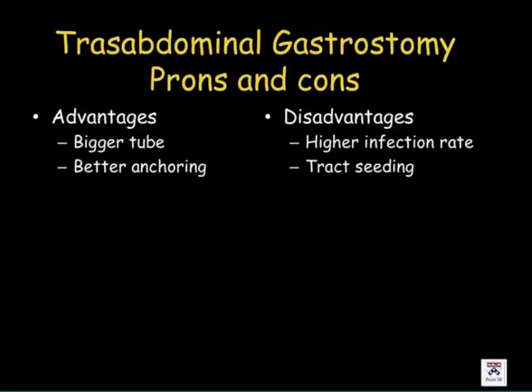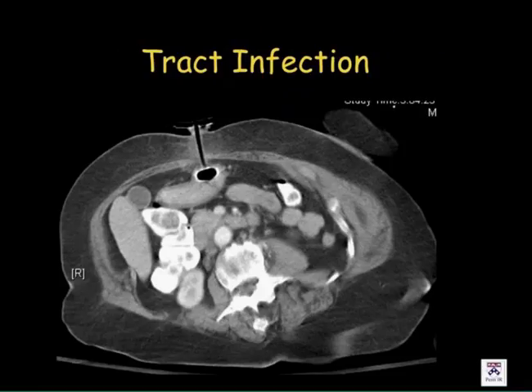The disadvantage of changing the PEG tube or transoral tube is that you have to give sedation. You guys probably saw how it's already removed. You have to pretty much rip the gastrostomy tube out of the body and put a new one, whereas replacement of the balloon tube is pretty much painless.